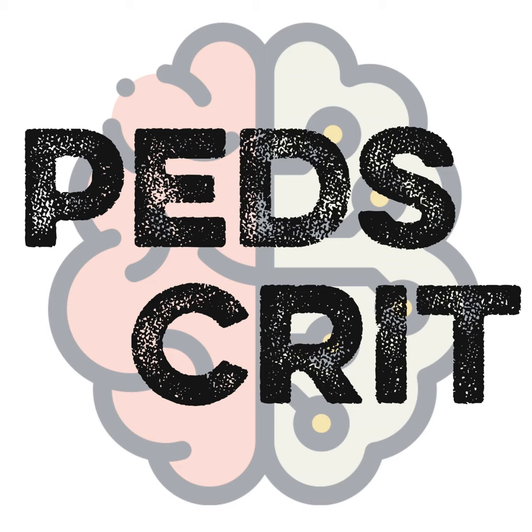Correct. Yeah. So at a lot of places, they're also doing an ACT or an activated clotting time hourly because it's almost a point of care test and sort of measures the clot formation in whole blood. How are you interpreting that value in this setting? So I think ACTs are really helpful as a trend, especially since most places tend to get them every hour, every 2 hours. And like you mentioned, Alice, they're great because you can do them at the bedside. You use a small amount of blood, you get results immediately. And so I think it's a nice trend to have, especially if we see a significant increase or decrease, then I want to know what's going on with the patient.